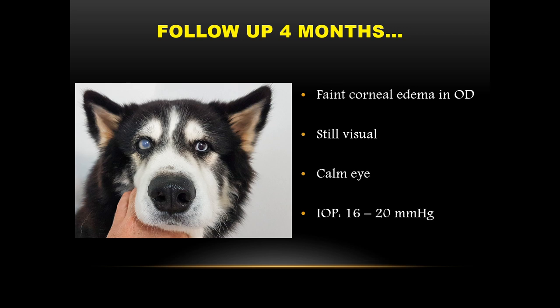Dr. Pedro is asking how long could you keep the IOP down? You mean after the laser? I didn't understand your question. Or after the laser, you're talking about keeping the drugs after the laser? Dr. Fernanda is asking, what is the rate of corneal ulcer after the procedure? None. Never had a corneal ulcer after laser.